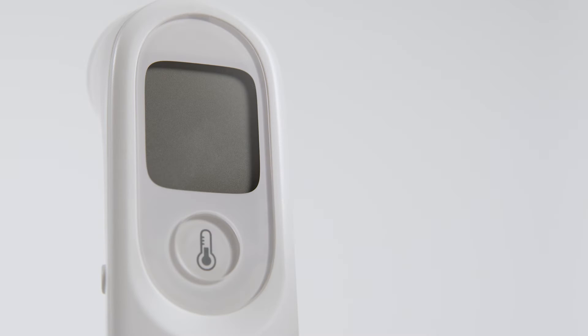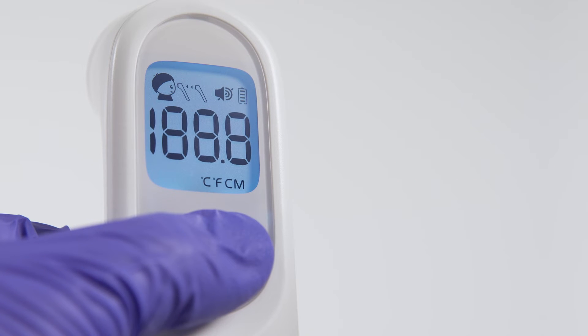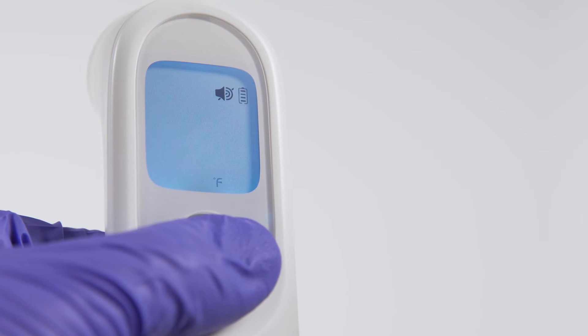It's easy for users to change settings based on their preferences. To switch between Fahrenheit and Celsius temperature scales with the device powered down, simply press and hold the Take Temperature button for 8 to 12 seconds until the temperature unit is indicated. Press the button again to select F or C, and then press and hold once more to confirm your choice.